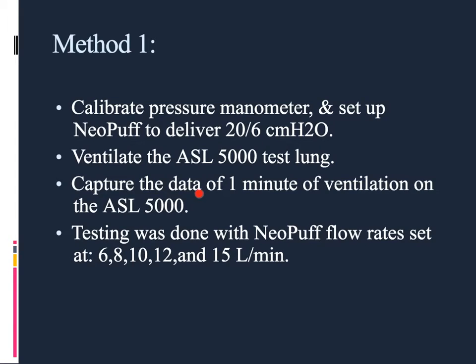And then I would capture all the data on the ASL5000. It's got a very precise mechanism for capturing the data and doing its analysis. So all the testing was done measuring the flow, the pressures, and the volumes delivered on the ASL5000, and used very precise data analysis after the data was captured.